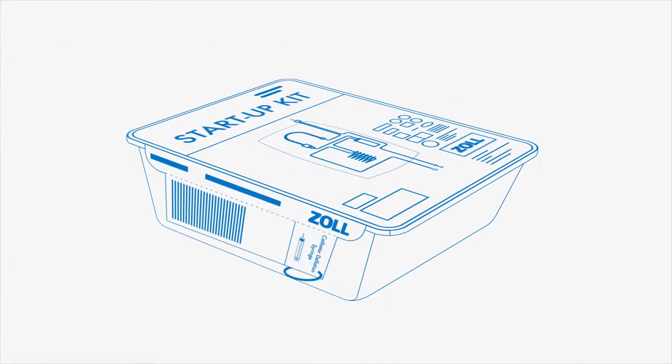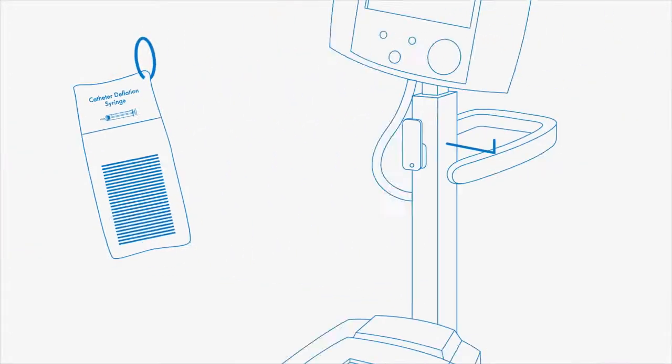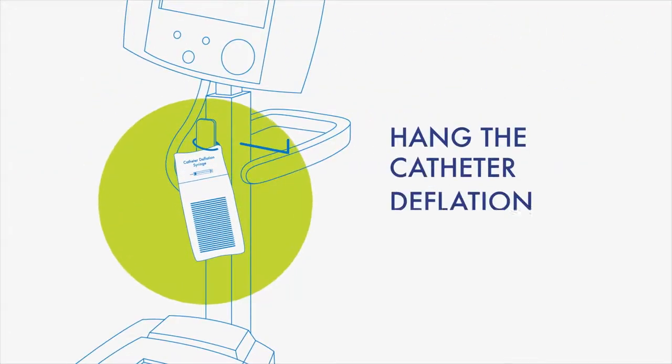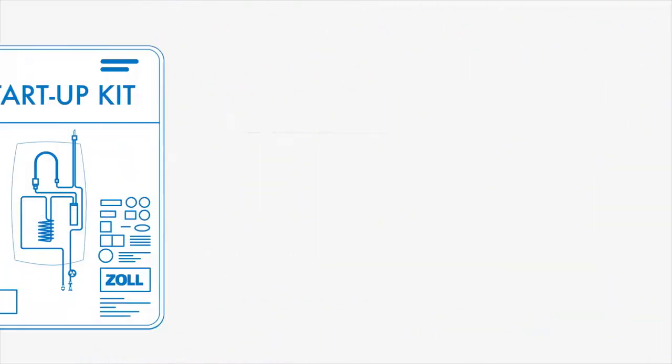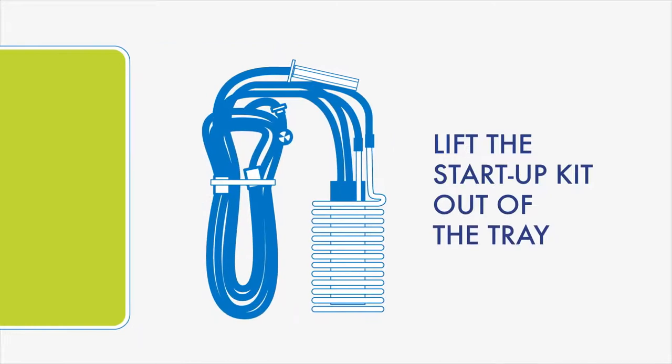Get the startup kit. Remove the catheter deflation syringe bag and hang it on the console hook. Peel open the startup kit. Lift the kit out of the tray.